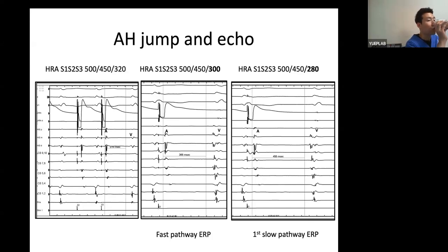Second thing that we did, I don't know whether you guys have seen it or not, there's a venous sheath that has a locking head. A 7 French venous sheath, we put it in, it has a locking head, we put the catheter in, lock it, so it doesn't move around. And then we put a tower at the top, do whatever we need to do, and maintain a good His bundle EGM AV ratio. That would give you beautiful traces. Then we do not have all this debate we're having today. Okay?